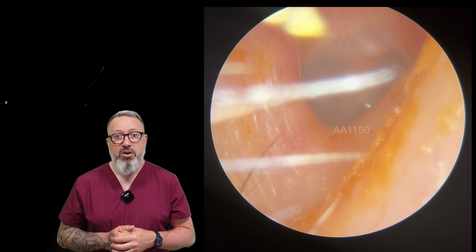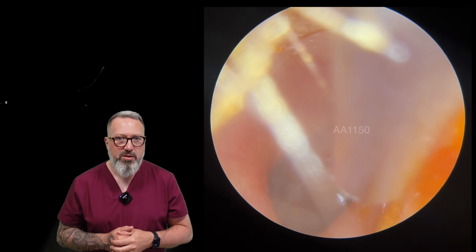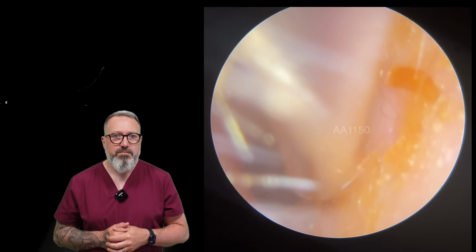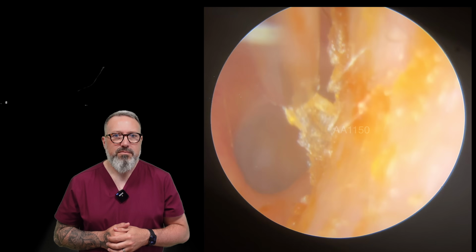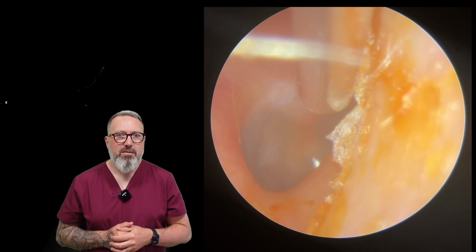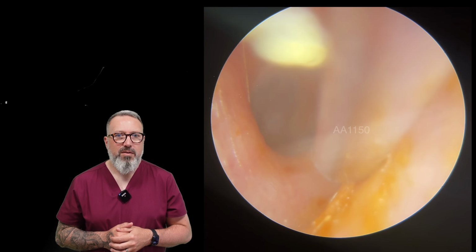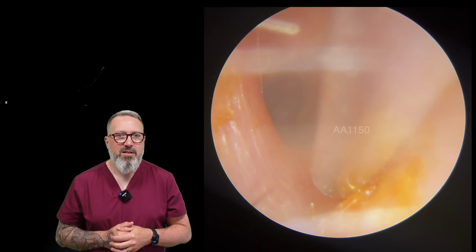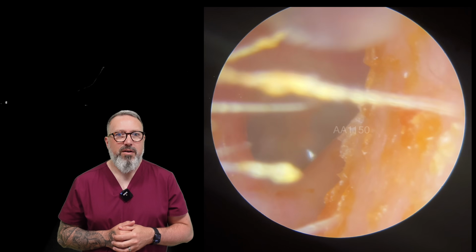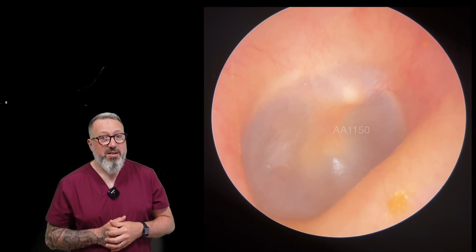Eardrum looks really good. There's just a little bit of dry wax around the outside edge. So we're just going to grab that bit with the fine end there. Looking good. You can see he's trying to see if this last little bit here will break away. A bit of tidying up around the outside edge. But that eardrum is looking nice and healthy in there now.